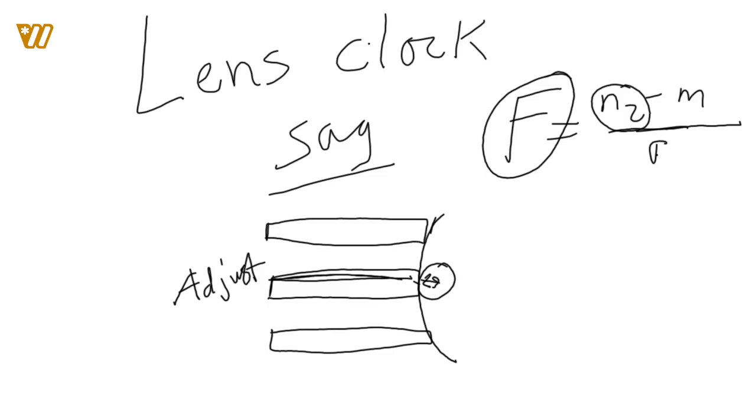Okay, so the natural question that would come from that is, how do you stretch this concept? Well, naturally what you would do is say, okay, let's use the lens clock on a lens that has a different index than what it's calibrated for.